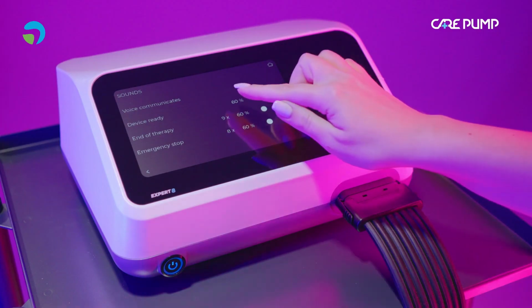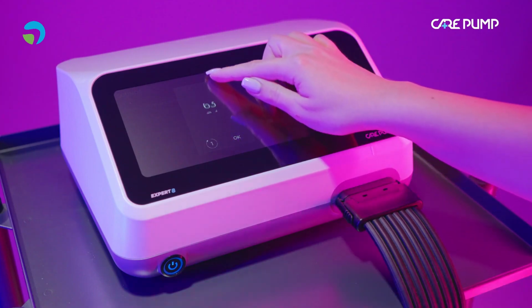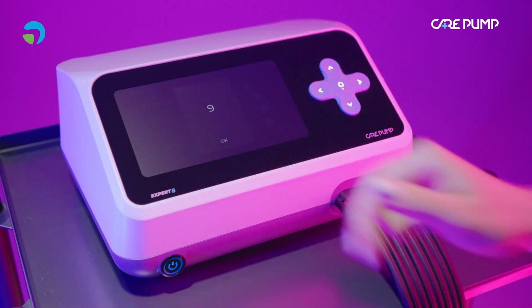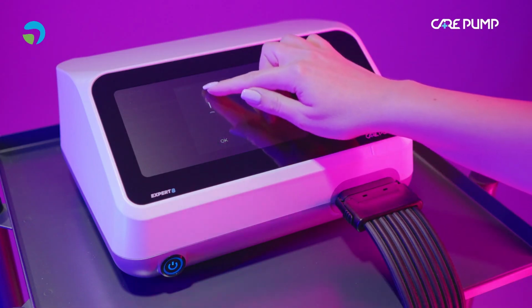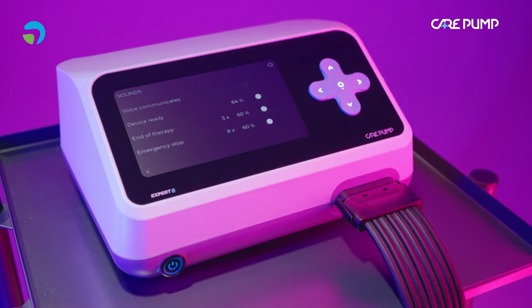To adjust the volume of sounds, press the percentage displayed next to each option and then set the desired value. For notifications about the end of therapy or emergency stop, you can additionally set the number of repetitions from 1 to 10.